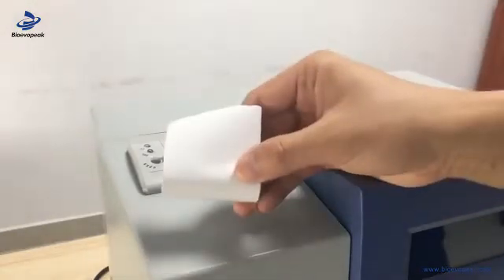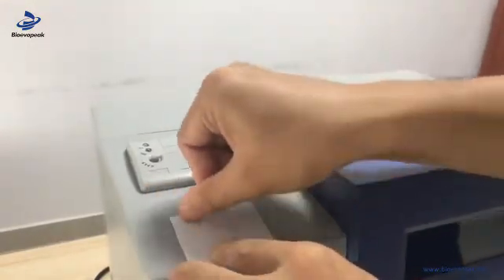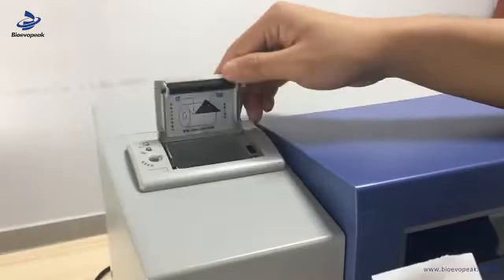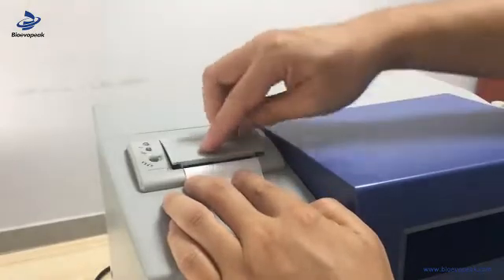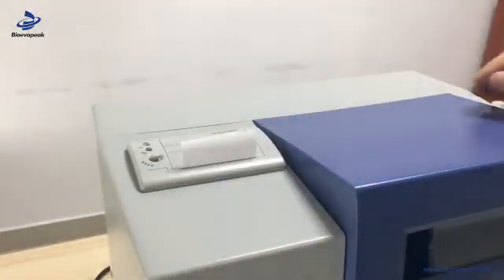We need to let the thermosensitive side face toward us. We can check by our nail — if there's black, it is this side. Then we open the printer and put the paper inside. Pull a little bit, then close it. Printer paper installation is finished.